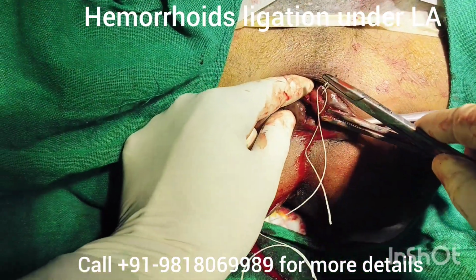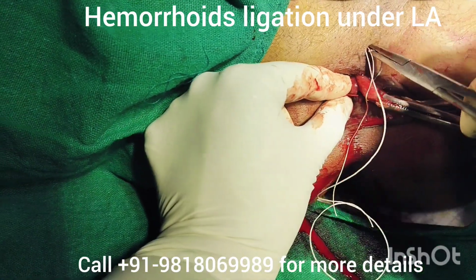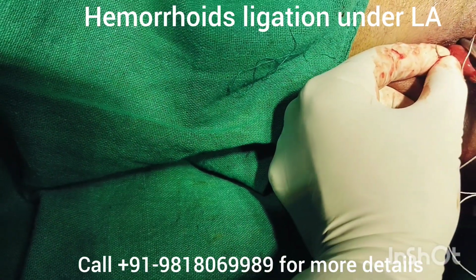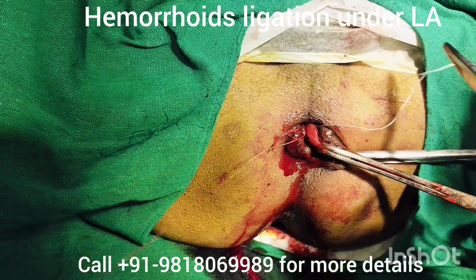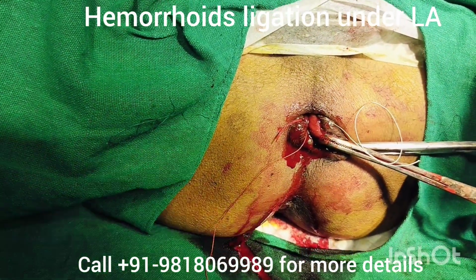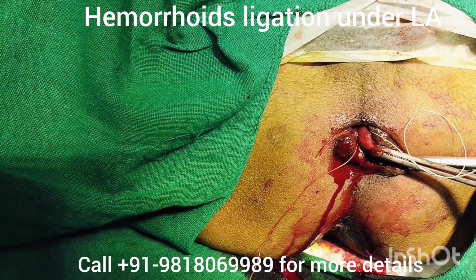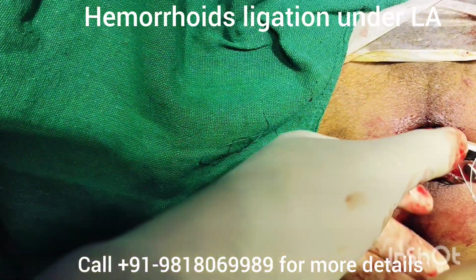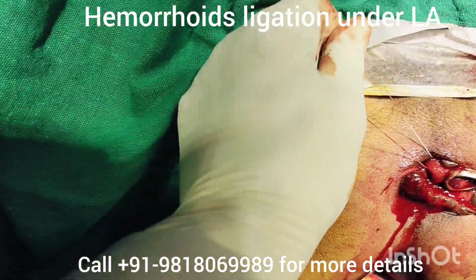This is being transfixed. The pedicle is being transfixed at base and this will be ligated. First knot will be placed medially and after that we shall place other knots to secure it, to ligate it properly, to strangulate it completely.